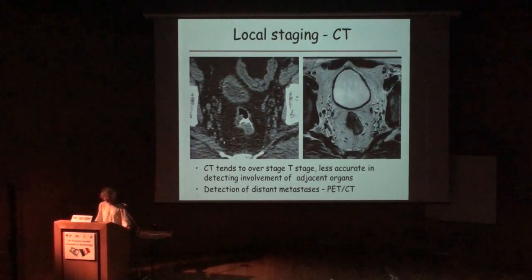Not really marvelous. Look at this, the same patient. This is from when we are doing the CT for radiation planning. So this is his CT, and this is the MRI. You don't see anything here. You don't see the mesorectal fascia that is so nicely outlined on the MRI, the mesorectal fascia, all the lymph nodes, and you see the tumor. It's only the tumor you can see here, but the rest is blurred.